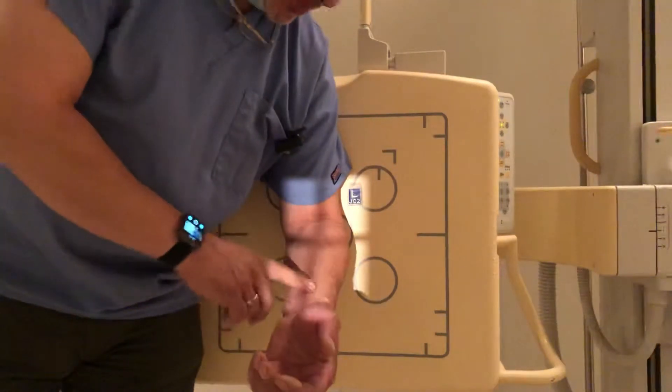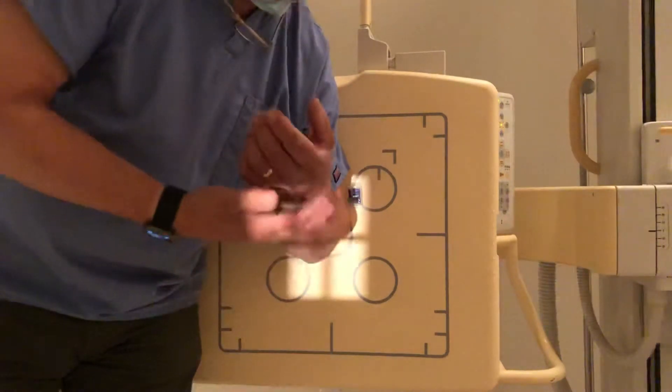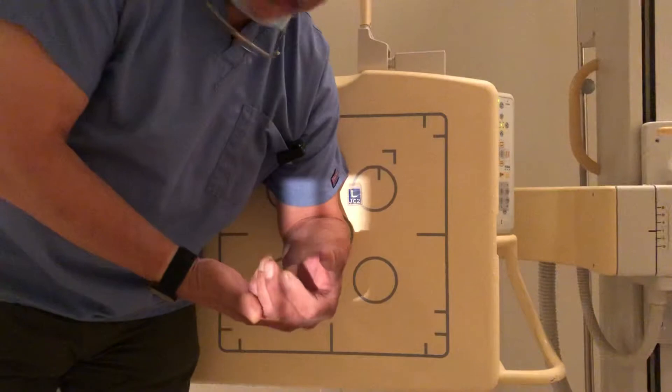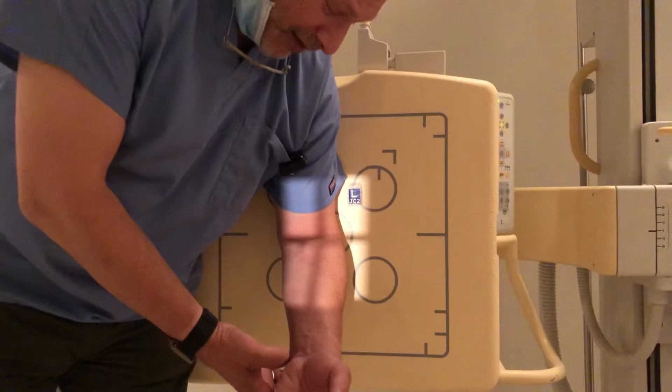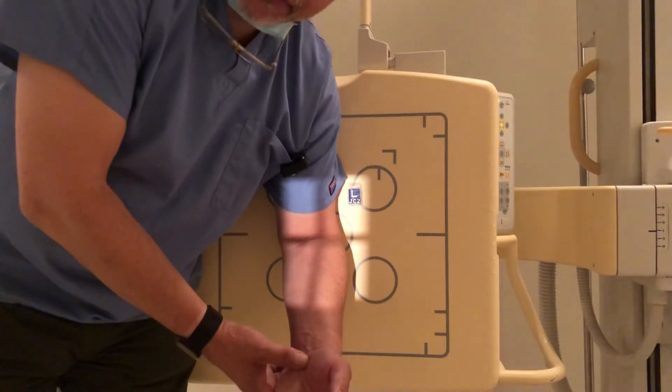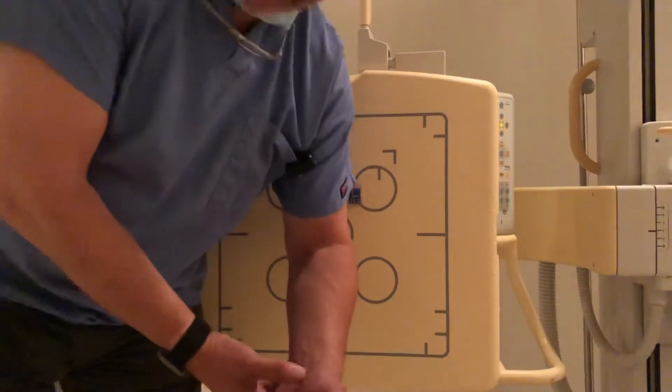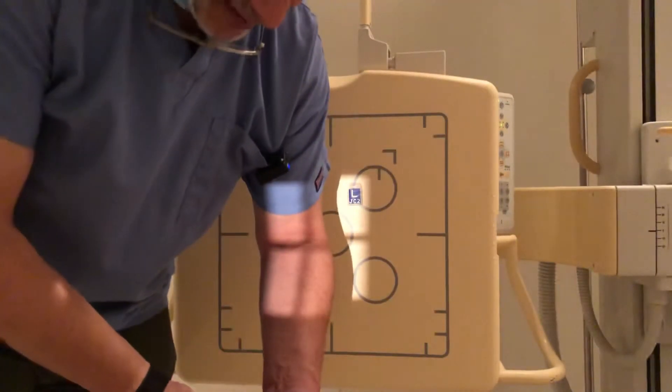So you're going to line up this way, make sure the shadow is going straight down and then have them with their hand hold their wrist and let them bring it down as far as they can. You'll be surprised, they can usually get pretty far down. Whatever their level is, tell them to stop, shoot the x-ray and then you'll bring them away from the plate a little bit for the other AP.